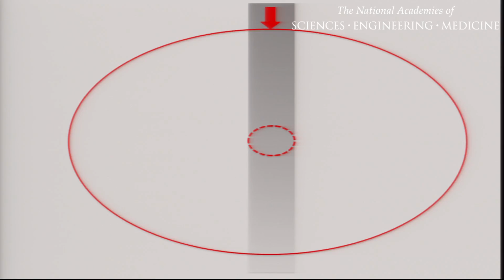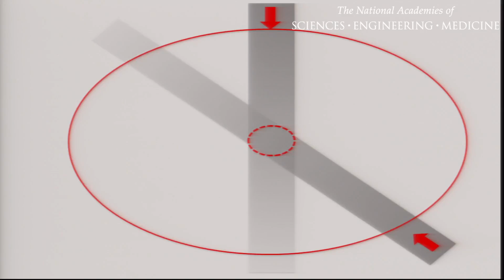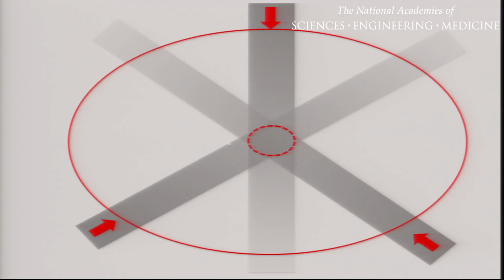Looked at a different way, this is a photon beam entering a patient. The tumor is in the center of the body. You can see the beam fading out as it passes right through. We get around this problem, of course. If we were going to try and treat a tumor to dose X, you'd have to treat the more superficial tissues to twice that dose if we treated with single beams with photons. We don't. What we do is we summate beams. We have multiple beams coming from multiple directions, and we do this with increasing levels of sophistication, up to what you've seen in the last presentation.